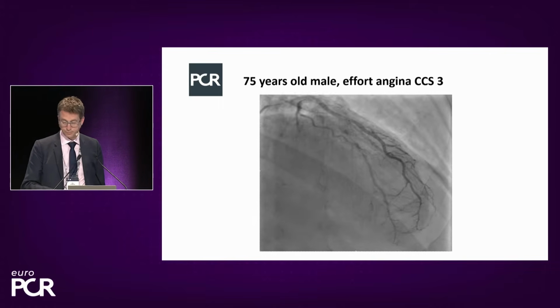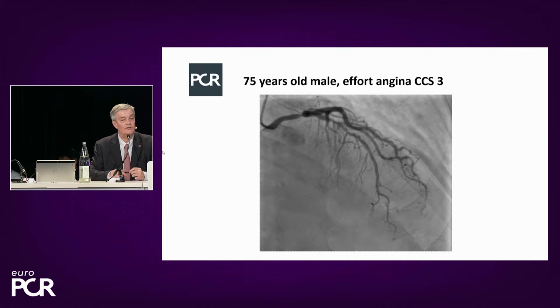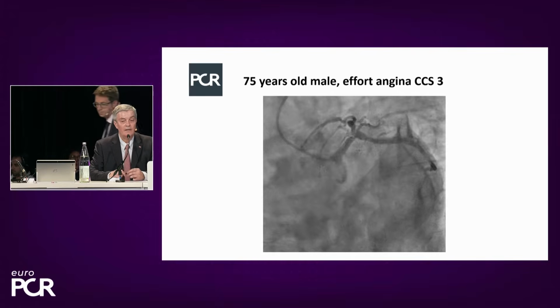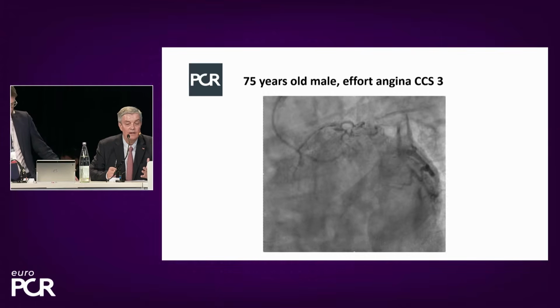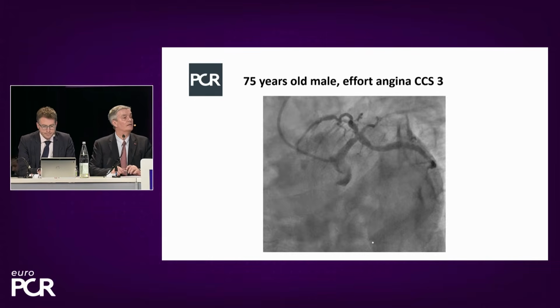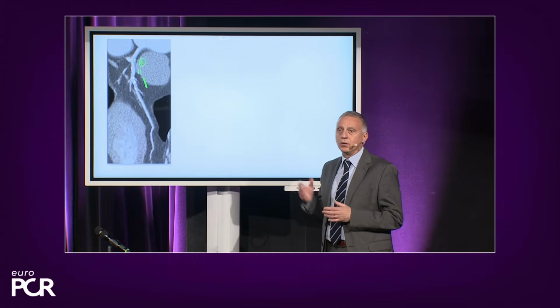Okay, Francesco, can you lead us through the anatomy that we see on the angiography and describe the plaque distribution? Because here we see trifurcation, but most of the plaque seems to be in front of the ostium of the LAD. Yes, so we'll do that in a minute, on the basis of angiography, but I think it is important to remember Jens's suggestion about the possibility to use intravascular imaging to plan this kind of procedure in the case you are going to treat the left main.